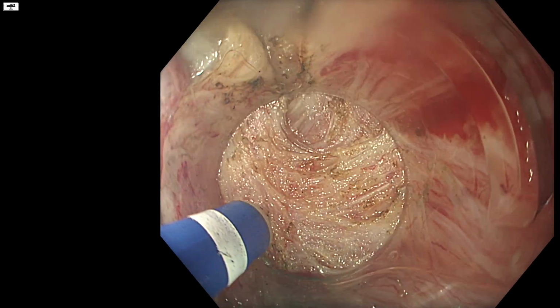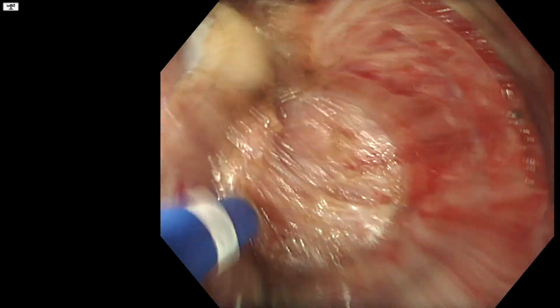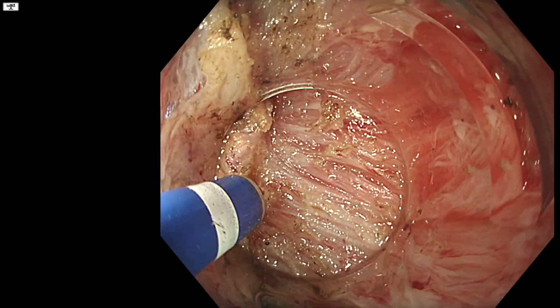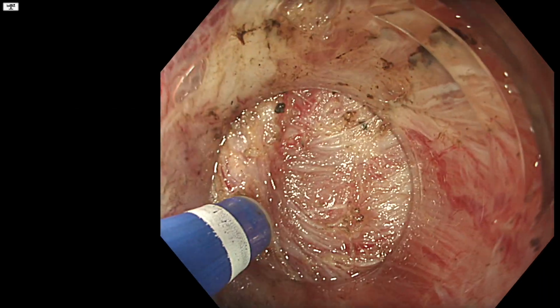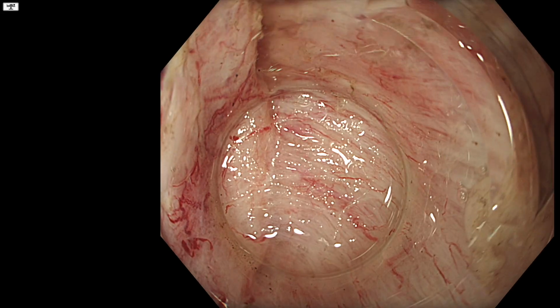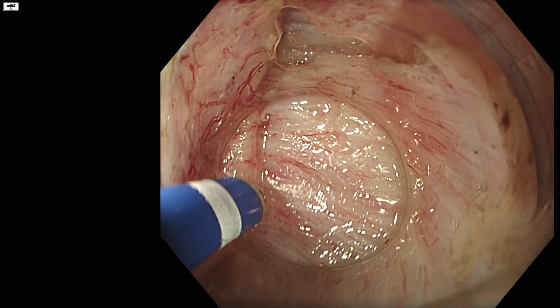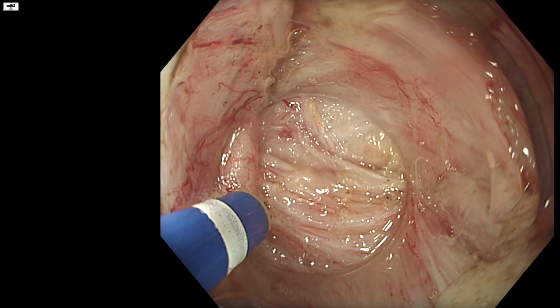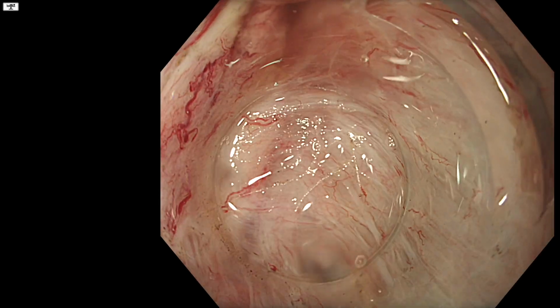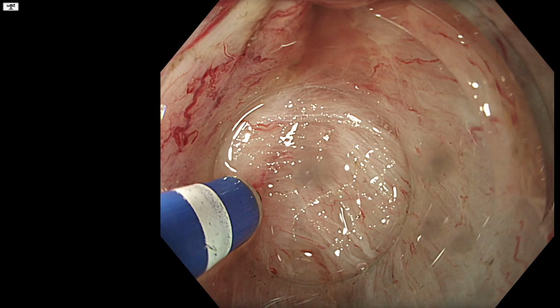Going back to the question I posed at the beginning of the video, why did we pick EID rather than TAMIS or TME? Both are clearly legitimate options for early rectal cancer, but I think neither was ideal here. TAMIS achieves comparable R0 rates to EID, around 90 to 95%, but it does require GA. It's a full thickness resection that opens the pararectal space, which then can have consequences for rescue or salvage surgery, and it's considerably more expensive.